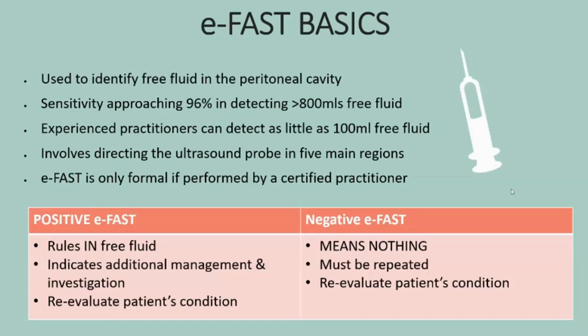It indicates additional management and investigations should be used if there is free fluid detected. And it's important to reevaluate the patient's condition in a positive EFAST. For a negative EFAST, it actually means nothing. So it's important to repeat EFASTs that are negative and to do serial ones. And once again, also reevaluate the patient's condition. So whether an EFAST is positive or negative, it should never be used in isolation, and the patient's clinical picture should be taken into account.